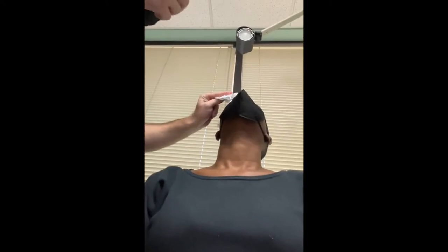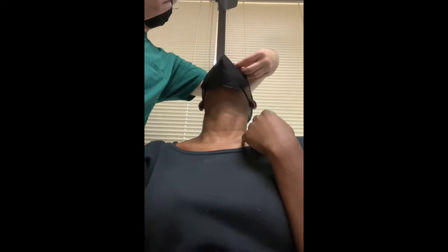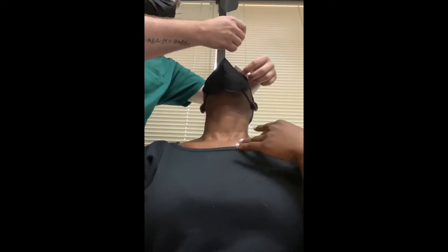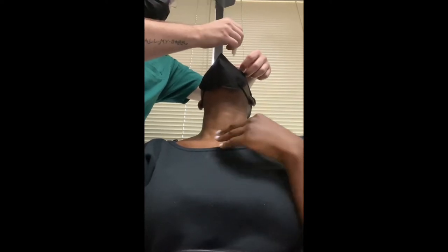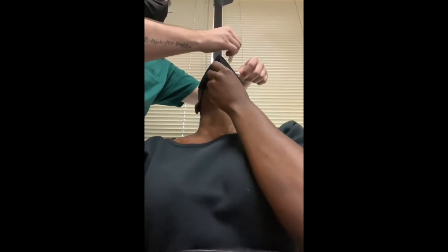We have super fancy sunglasses. Okay, here we go — the first drop, just look towards the wall for me. We'll do the secondary one after. I'm sorry, I'm so dramatic! It's totally fine. Go ahead and open your eyes the best that you can. I put it in the tear duct — just blink a few times and it'll slowly work its way in.